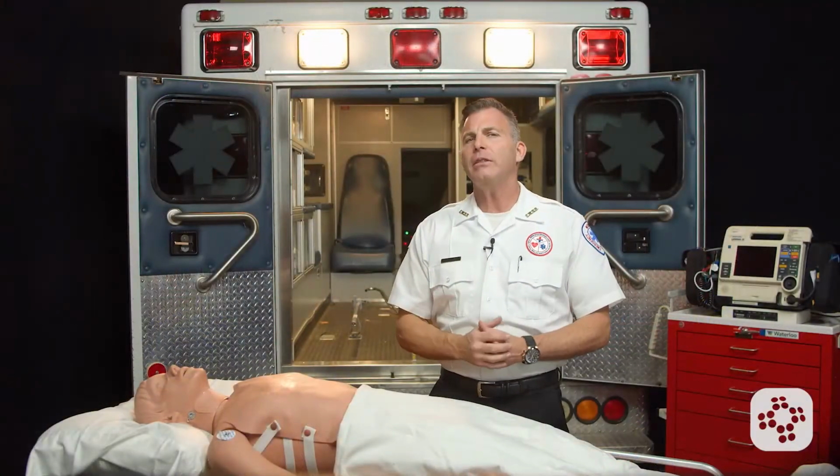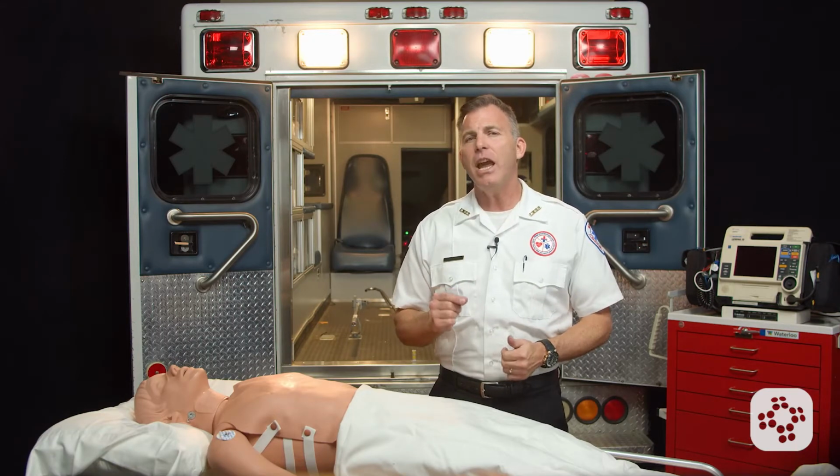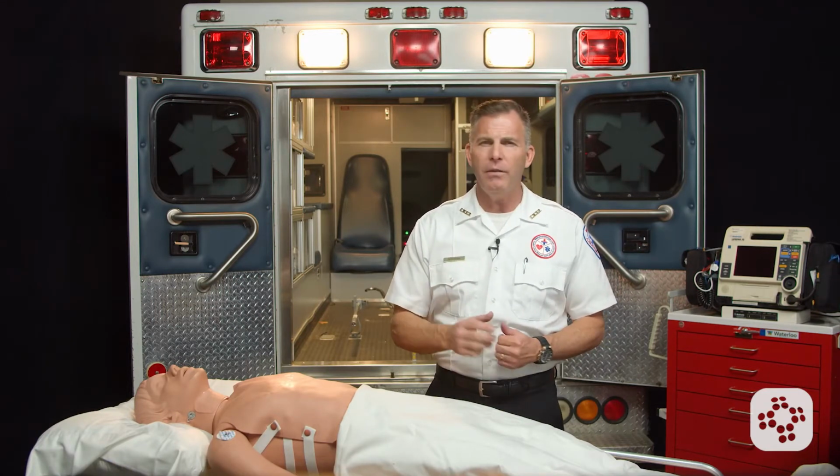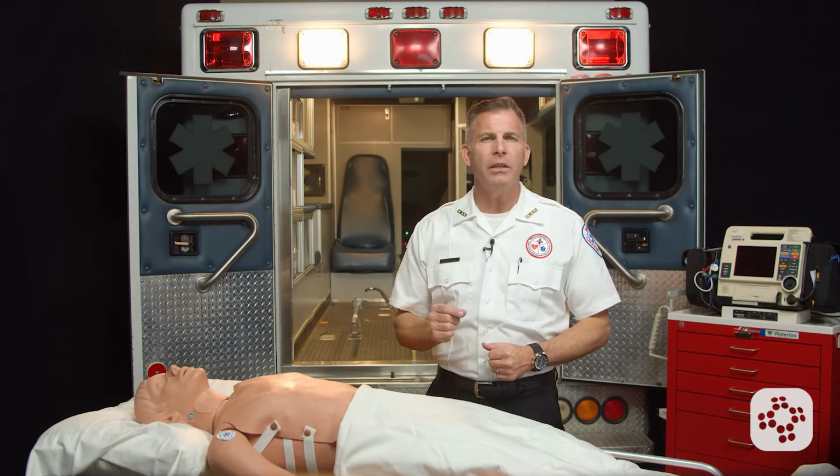The rhythm on the ECG is a normal sinus rhythm with PVCs, or premature ventricular contractions, at 78 beats per minute, but it's irregular. Knowing that a rhythm with multiple and frequent PVCs could deteriorate quickly, we're going to start an IV in order to administer IV saline and have a route for medications.